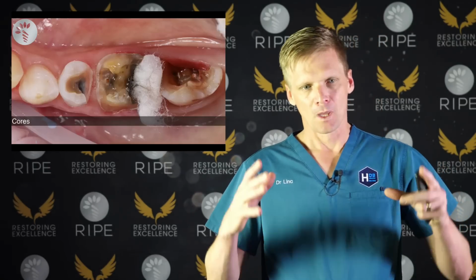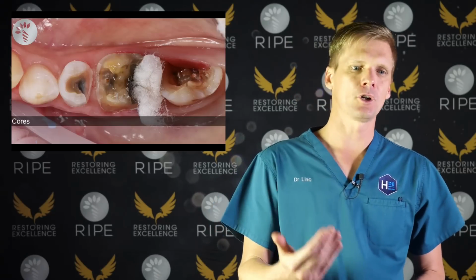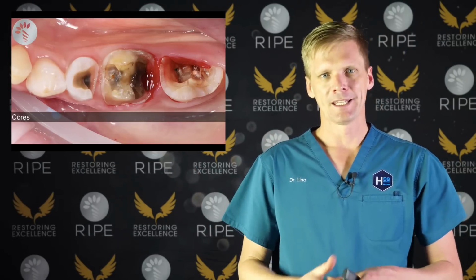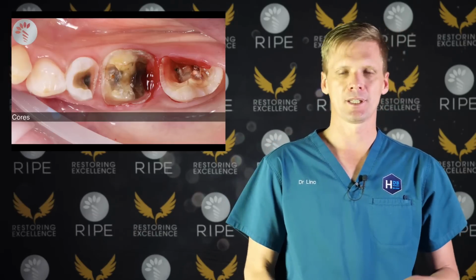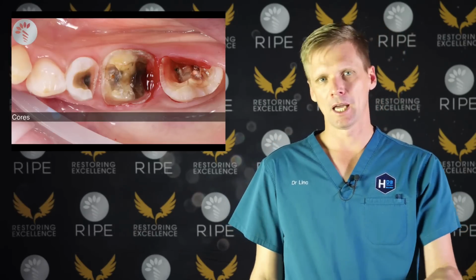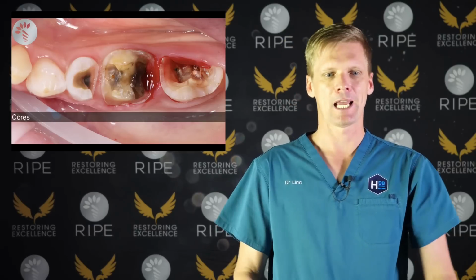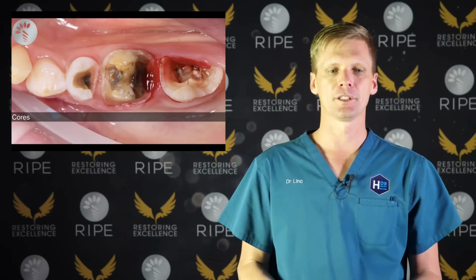So you can see here, we've got the blood bath. This is quite common, and this was from today. I removed some of the old fillings. There's no way to prep down to those margins and clear them out without removing a bit of tissue, and then you get bleeding, and the tissue was inflamed to start with, so now we've got a blood bath. How do we control the tissue?